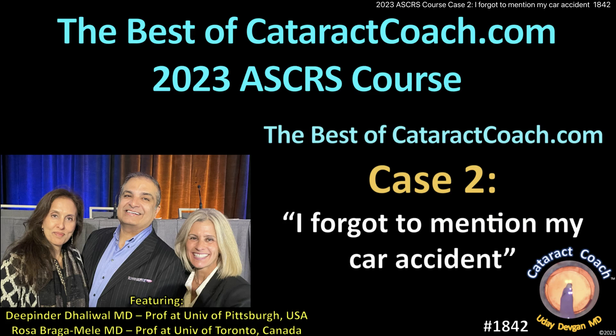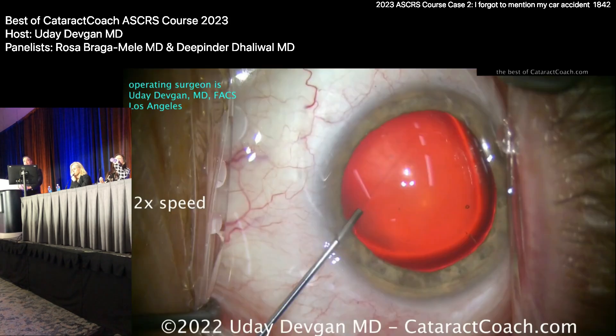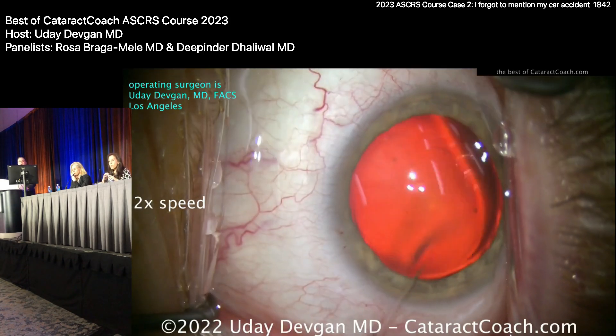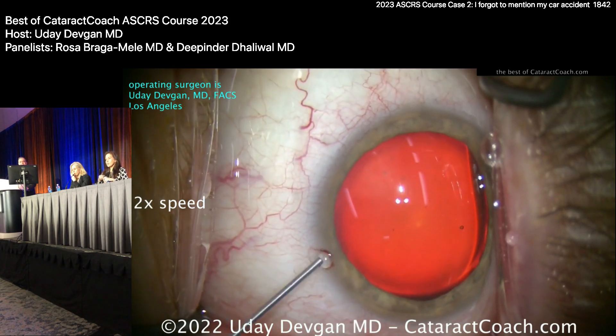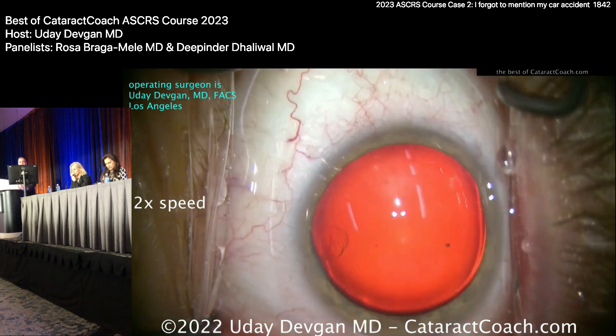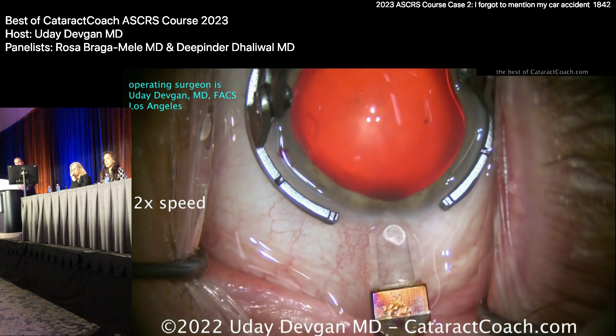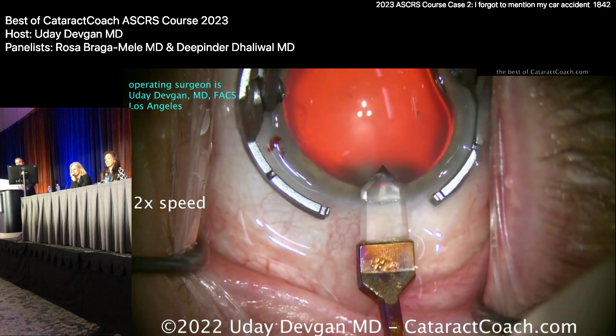From cataractcoach.com, more from our ASCRS course. There's a patient whose second eye — the first eye received an EDOF lens and they were very happy. This is the second eye and they want the exact same EDOF lens. Starting off the case here, looks pretty good, good dilation — not too bad, a Beverly Hills cataract I can handle.